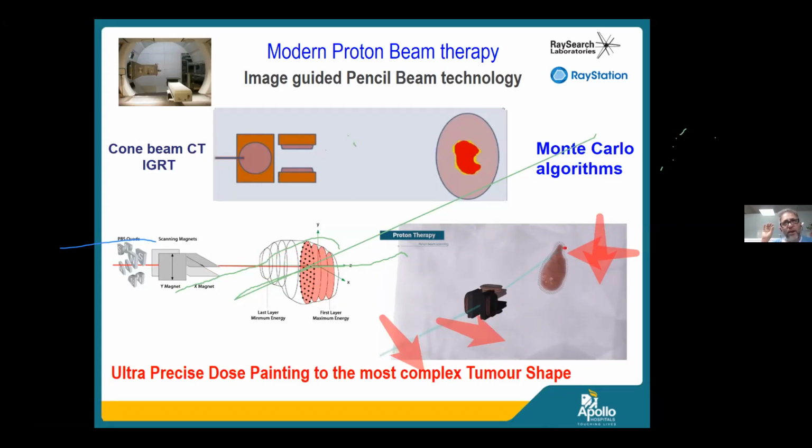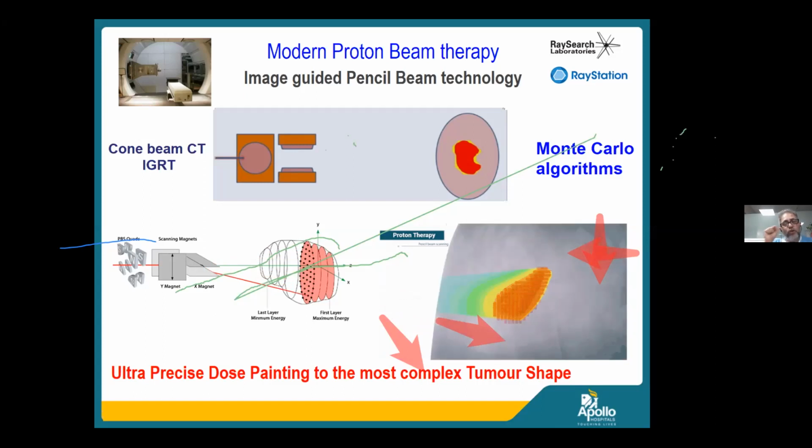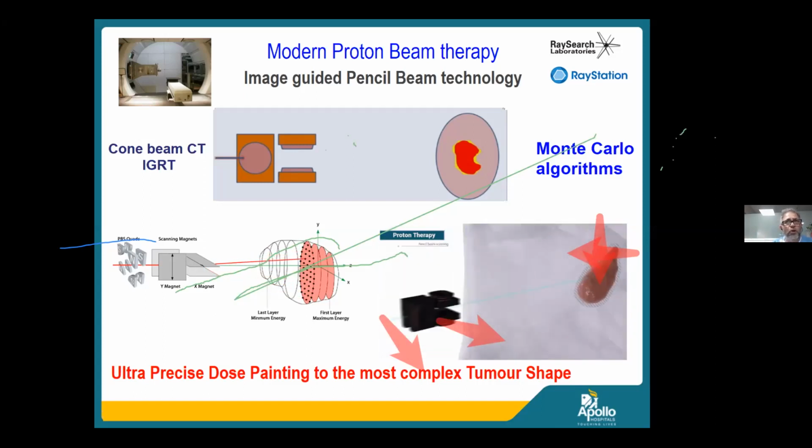You may have a very good planning system, a computer which calculates the doses, optimizes the beams and helps in delivery of the treatment. But if you do not have a handle on whether you have actually positioned the patient accurately, and make sure that the beam actually goes to the intended target, you actually lose the whole concept.